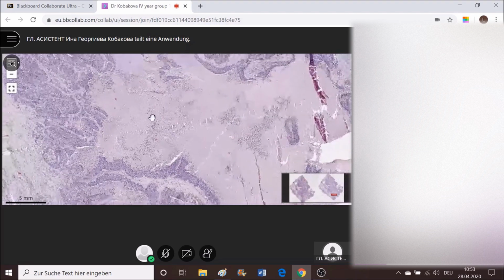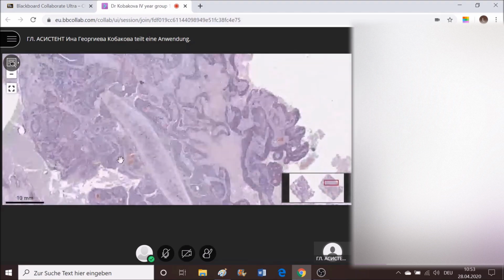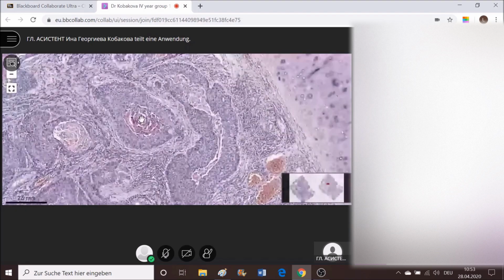Let's find a smaller nest to explain what is on the inside. That is even more recognizable. Take a look at these.